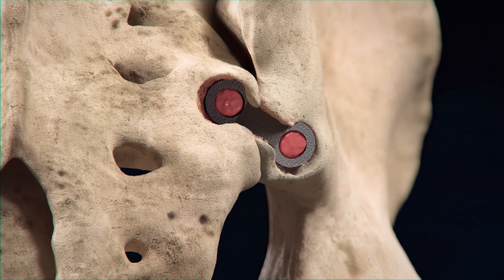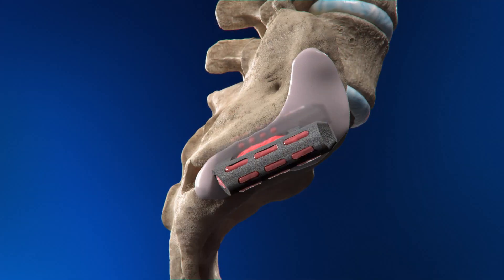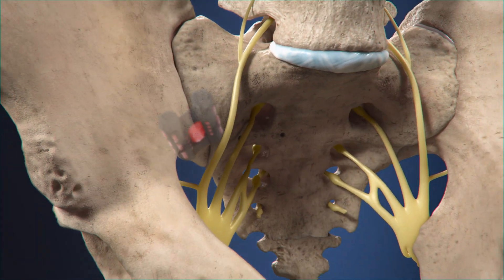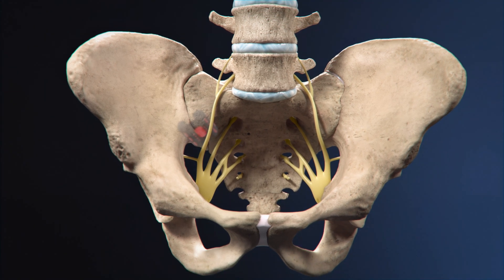The Catamaran is placed directly into dense cortical bone, avoiding the dorsal gap and following the natural pathway of the SI joint. The Catamaran's trajectory is directed away from critical neural structures using an inferior posterior approach.